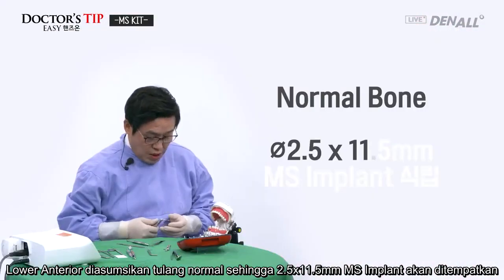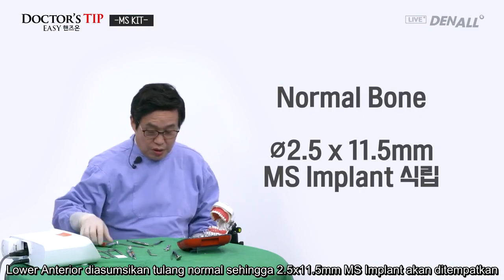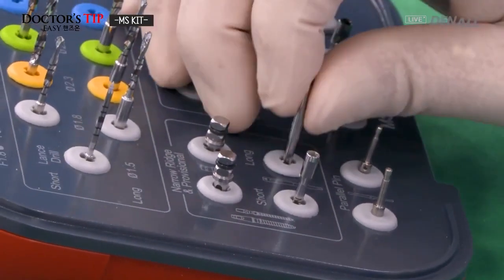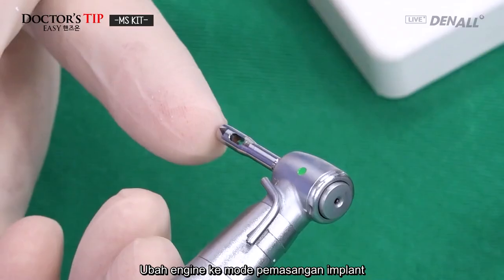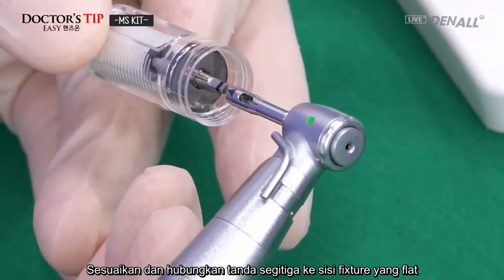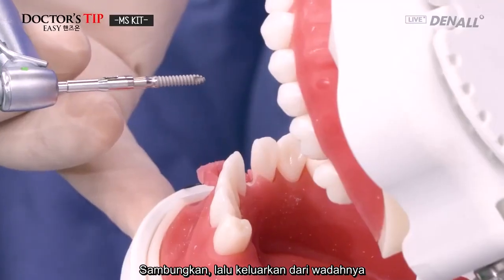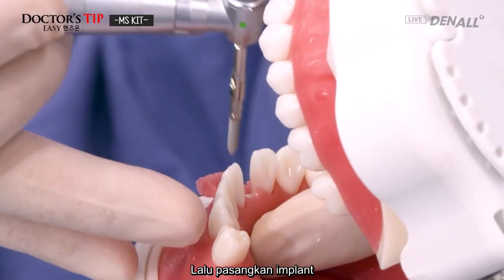And then, in the lower anterior side, let's assume it's normal bone. So the 2.5 by 11.5 MS implant will be placed. I will use the no-mount driver, and I use the long type. And change to the placing mode, which is marked with the triangle, and that needs to connect to the MS fixture's flat part like this. Connect, and you pull it out, and like this. Before pushing it into the mouth, you check that it's in the correct mode, and then place the implant.